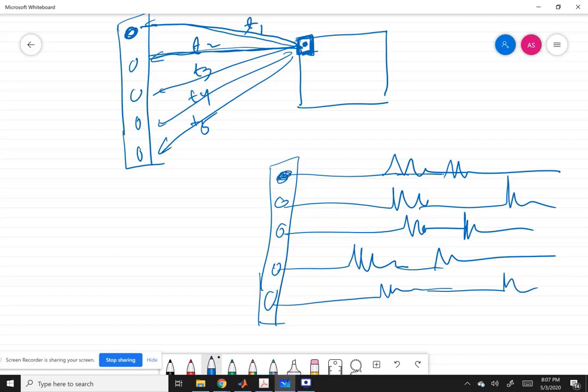Then for the first transducer, you have the radio frequency wave. You go till the point t1 and extract the amplitude there. Store it as a1. Then go till time t2 for the second transducer, and suppose you extracted the amplitude a2.